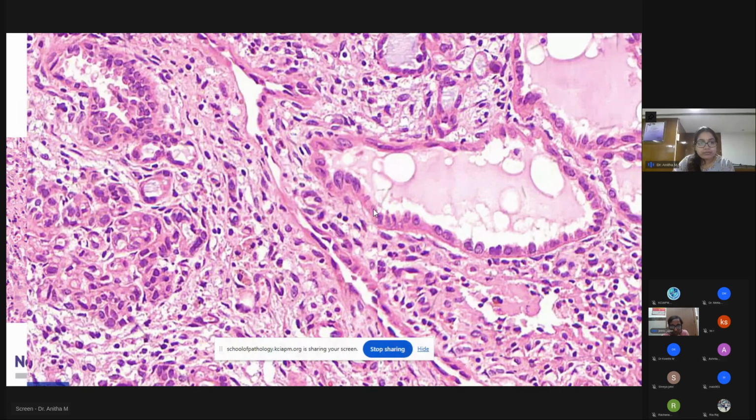See, there are small to medium sized tubules, and there are cystically dilated tubules, a tubulocystic appearance. And all these glands were supported by a thick basement membrane. The background stroma shows some singly lined cells within the lumen, which might be misdiagnosed as signet ring cells and all. But this is a classic morphological feature of nephrogenic adenoma, as you had described it.